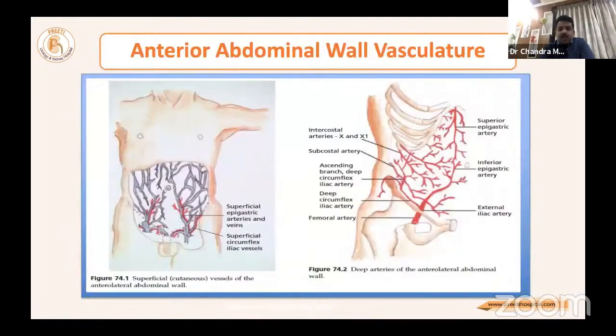The most important thing we talk about every time is the right side part of this slide, where the inferior epigastric artery is. A simple trick is you put a finger between the anterior iliac spine and the pubic symphysis center. From there, you go towards the umbilicus. That line should not have any part of your laparoscopic port or Veress needle. The superficial vessels will not bleed that much. Inferior epigastric artery and vein.